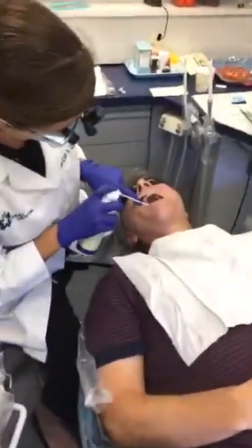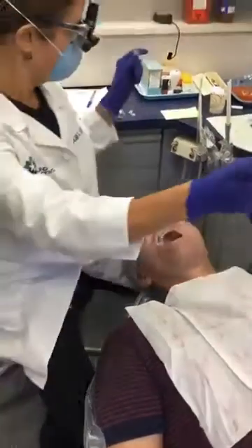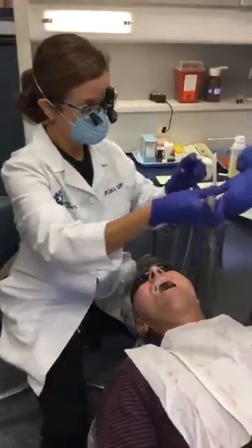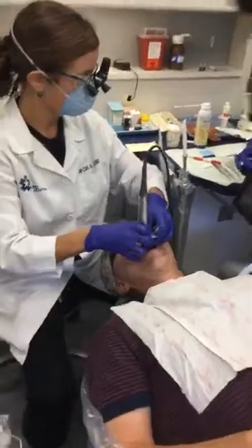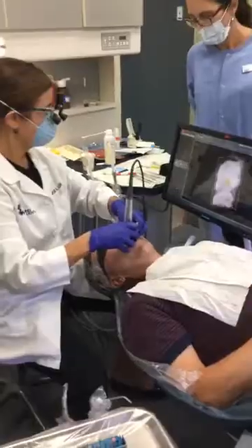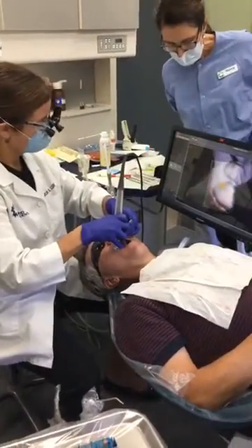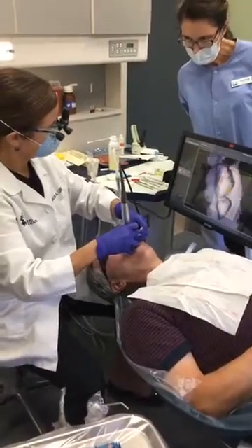The old way to do this would be using impression material, which sits in your mouth for about three and a half minutes. Then we pull it out and have to check it, and sometimes you have to redo it — it's tedious, it takes forever, patients hate it. With this, we can see instantly if the image we're getting is good. So if there's something we don't like, we can either rescan or, if it's something on the tooth we don't like in terms of the prep, we can redo it.